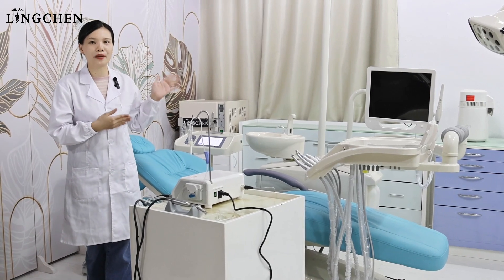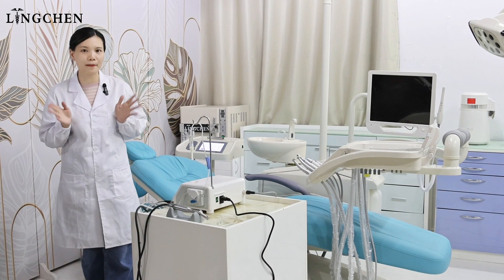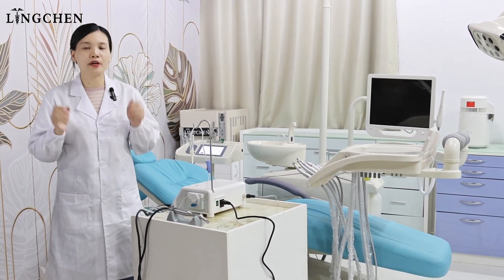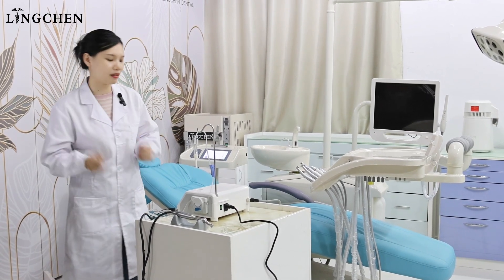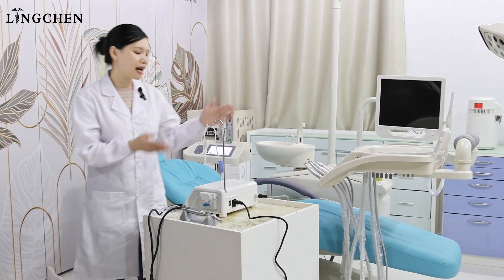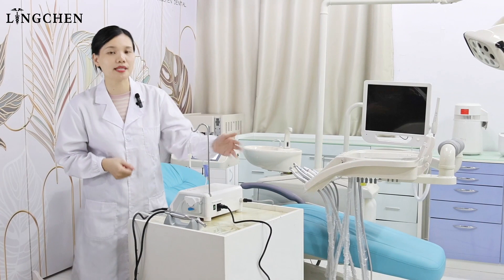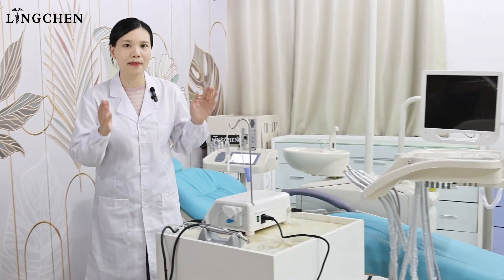Before we talk about our built-in implant dental chair, let's see how the traditional implants are working. Normally, for the preparation, it will take around 15 minutes to prepare the cabinets or the trolley. They put the implant model on the cabinet and prepare the cables and the tools for the implants. We can see the cables are really messed up.